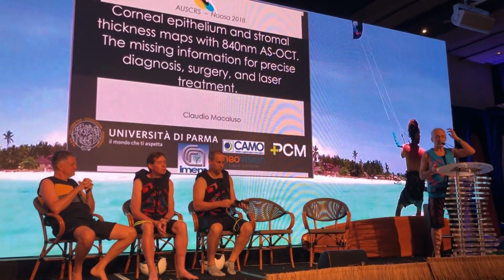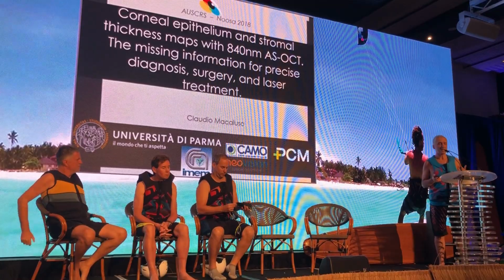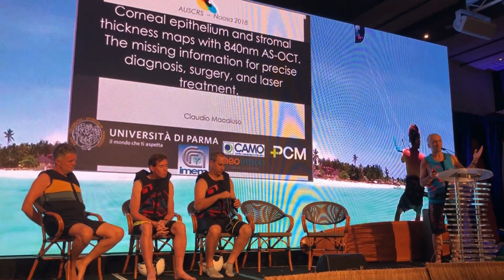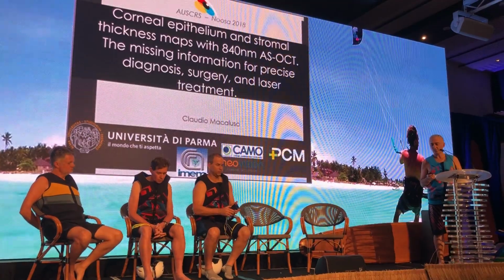I had the opportunity, for a couple of years, to use a very interesting instrument with a high degree of accuracy that I think might be very useful for all our surgeries, from refractive to corneal surgery to cataract surgery.